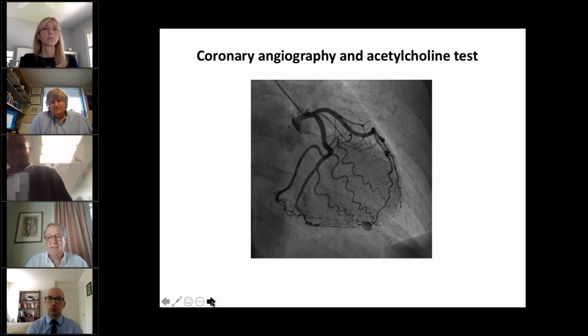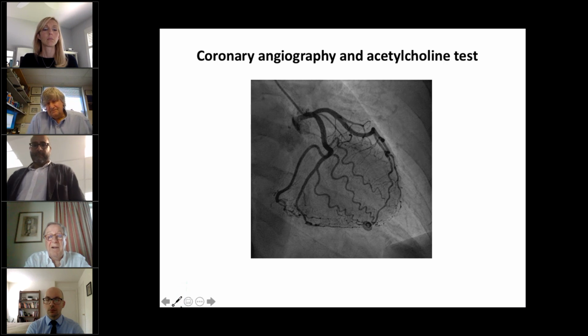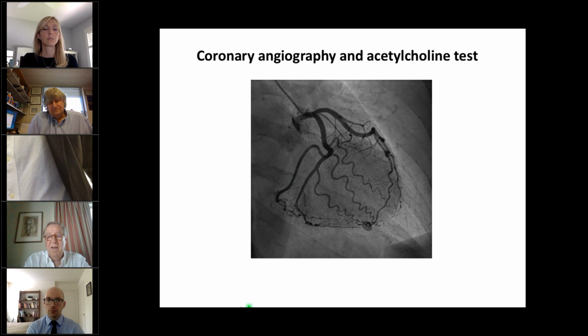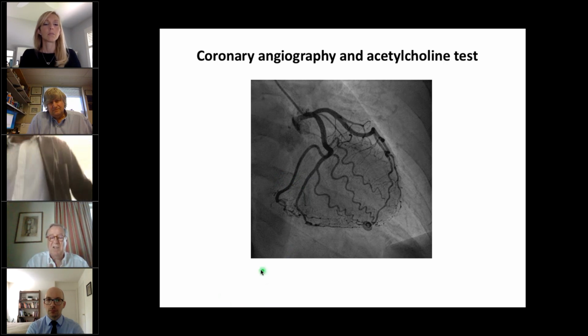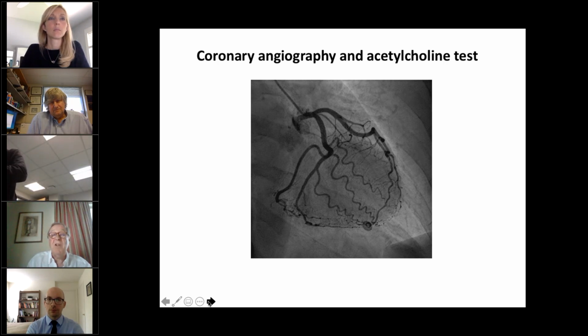Okay, this is another patient that has never done an angiogram before. She has chest pain predominantly at rest. This is the left coronary artery. You see the angiogram is unremarkable. Also, the right coronary artery was equally normal. So the patient has symptoms, has ECG signs, normal coronary arteries, and the patient is in the cath lab. You don't send the patient home with a diagnosis of chest pain with normal coronary arteries. You ask your invasive cardiology to proceed with functional testing. Next, please.